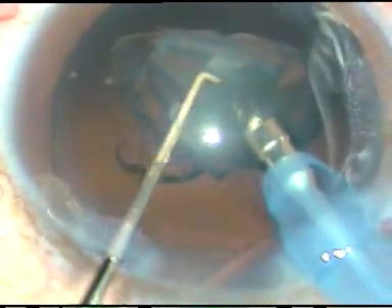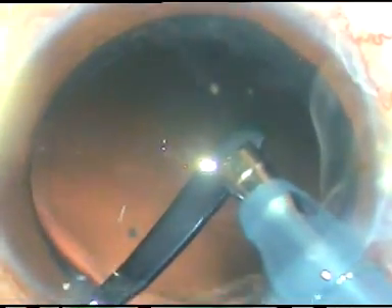This time I want to use PCP because — see, there is no support of epinucleus, particularly in these cases when there is no cushion of epinucleus. Once this instrument becomes of help — here it is. Place the PCP just over the posterior capsule and below the phaco tip and emulsify the last nuclear fragment.